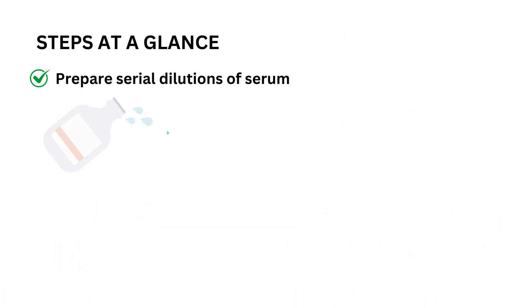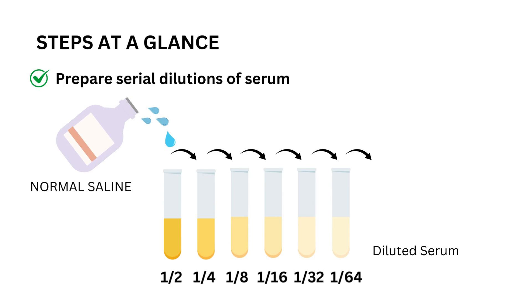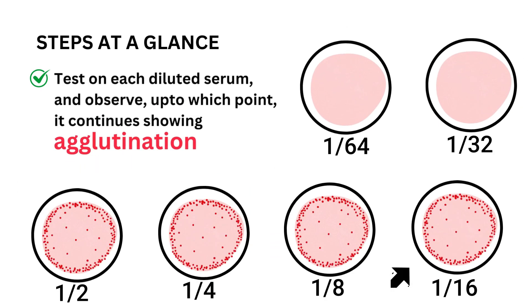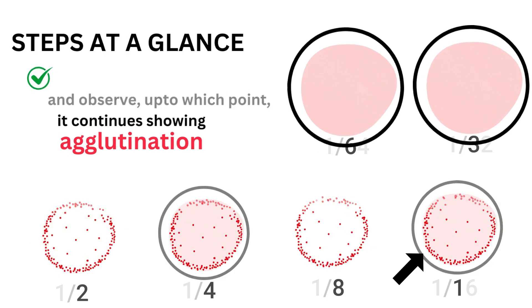The idea is we will dilute the serum serially in different concentration by adding saline preparation and test each of those diluted serum. We will observe up to which point the agglutination is being positive. That point will be the highest dilution of the serum at which the agglutination occurs.